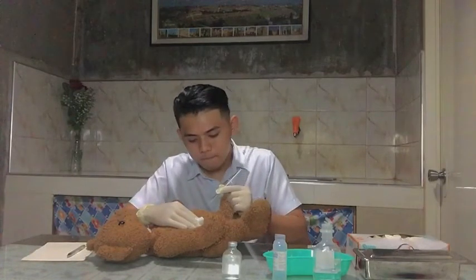When the needle is inserted, move your non-dominant hand to the end of the plunger. Some nurses find it easier to move the non-dominant hand to the barrel of the syringe and the dominant hand to the end of the plunger, and inject the medication by holding the syringe steady and depressing the plunger with a slow, even pressure. For support and easier injection of the solution, pressing the skin places counter traction.